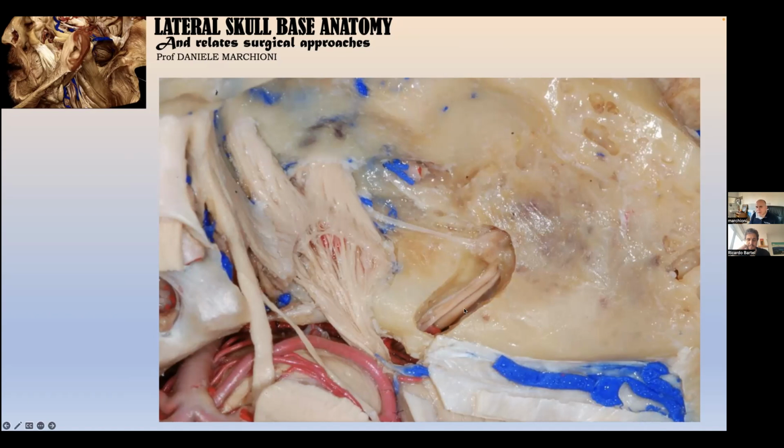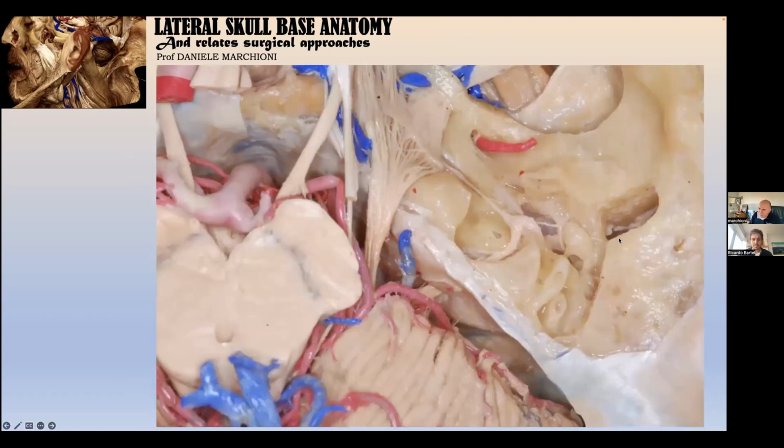Another important detail is the jugular bulb condition. If you have a really high jugular bulb, the space in order to reach the fundus of the internal auditory canal and the porus is quite narrow. So it's better to perform other kinds of approaches. The transpromontory approach is meant to reach from the external auditory canal, removing the eardrum, removing the ossicular chain, and entering into the promontory region in order to reach the fundus of the internal auditory canal and dissecting the internal auditory canal until the porus.